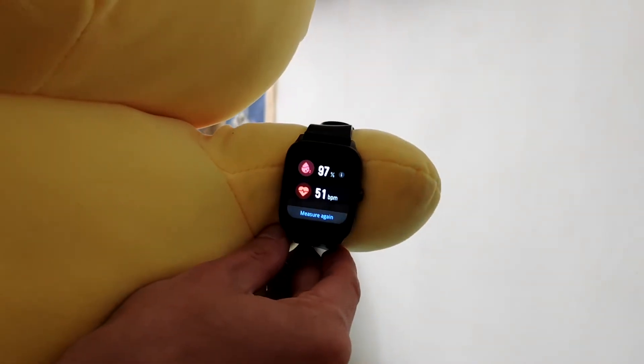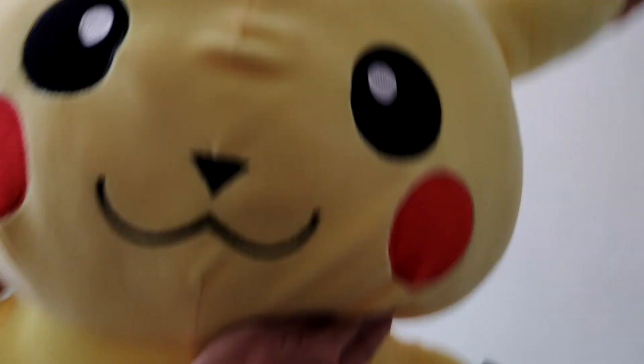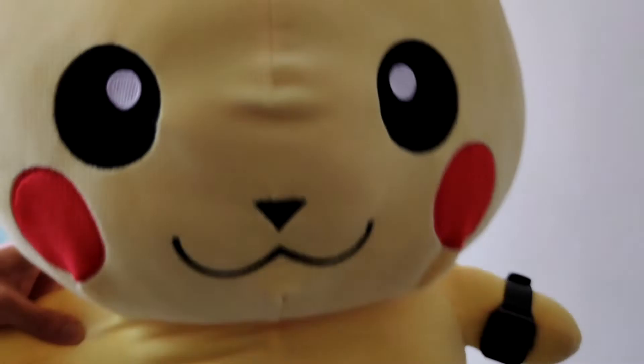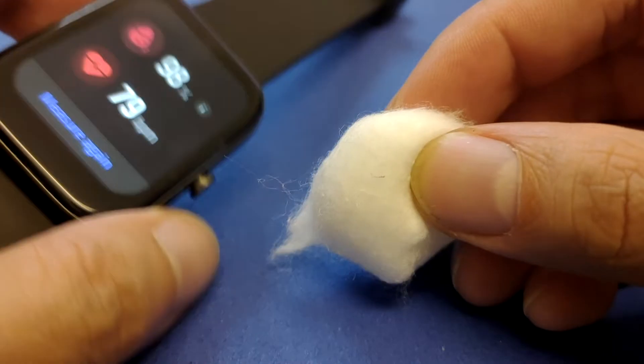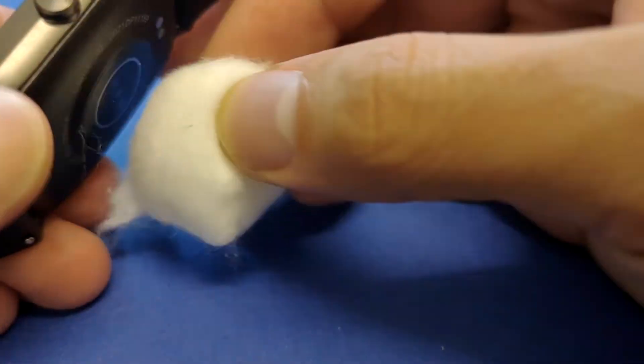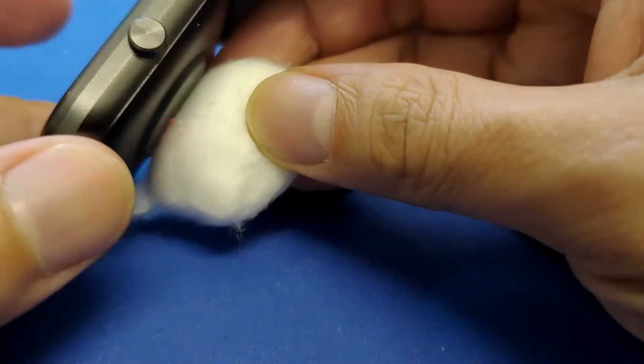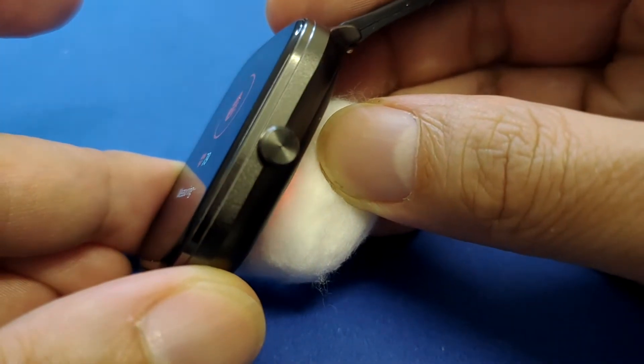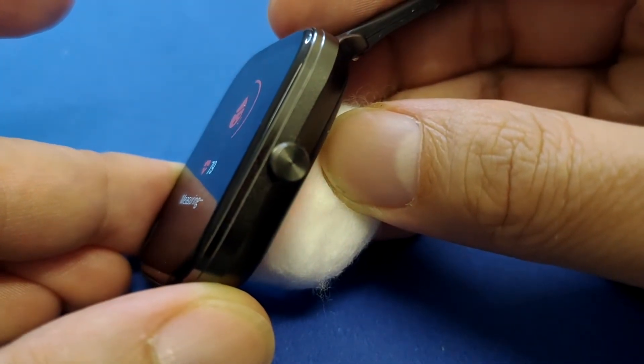It seems the smartwatch is working with Pikachu — showing 97% blood oxygen and some pulse rate. Pikachu is very happy! The explanation here: Pikachu is made out of cotton, and cotton actually absorbs the red light. When we calibrate our smartwatch, it uses reflective sensors that release infrared red light, and it seems the cotton does absorb that red light and gives us a result.